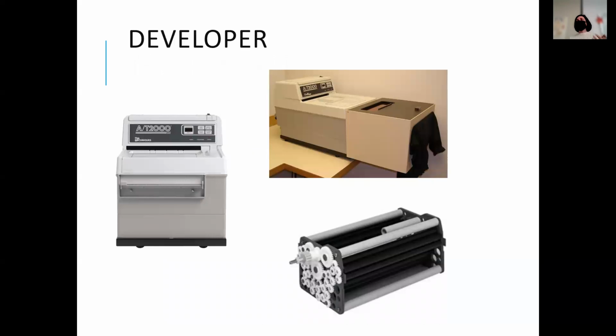Okay, so these are what the developers look like, and they're still out there. There's another one, and this one is really common. This is for when there's no dark room; this little box is basically the dark room. So it could be out on a counter. It's very unlikely, and there are probably very few and far between offices that still go this route, but it's possible that you could find it somewhere.